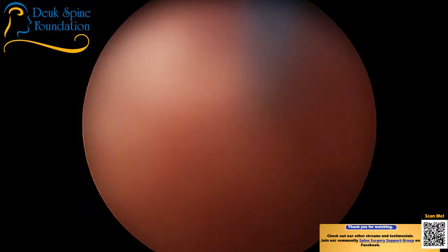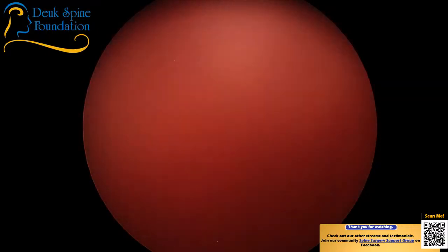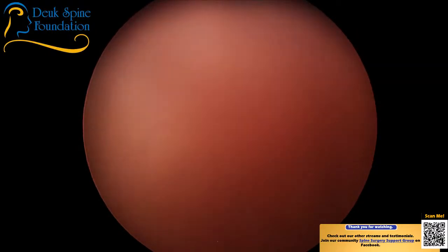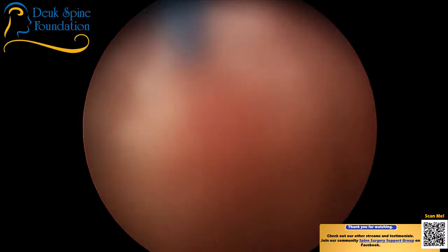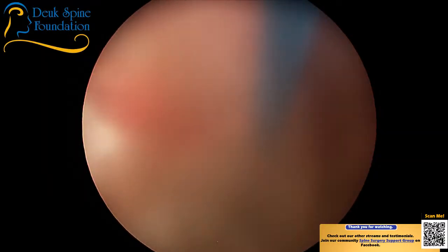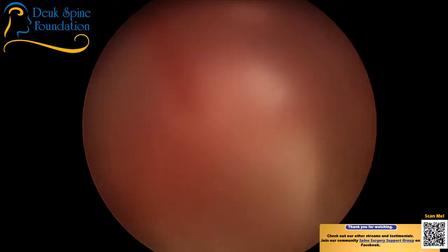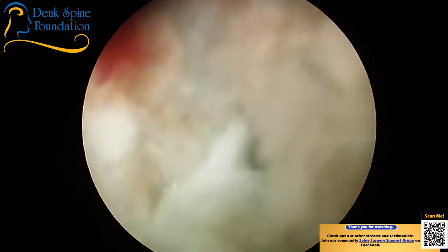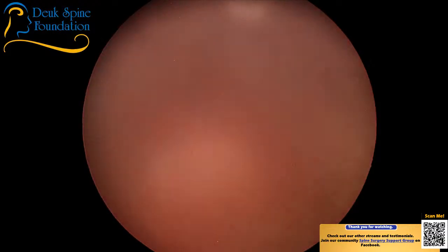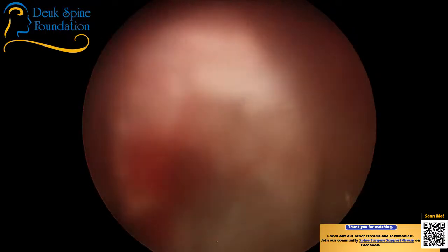But here's the tear that I'm working on right now. It's just below the little bleeding we got, to the right of it. And I apologize for the bad view. Fortunately, I've done a couple of these, so I know what to do. Is she moving? Yeah. All right, so that's not much fun. Let's get the grabber, take the laser.